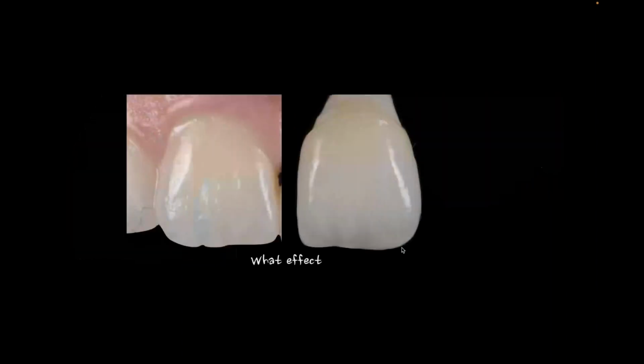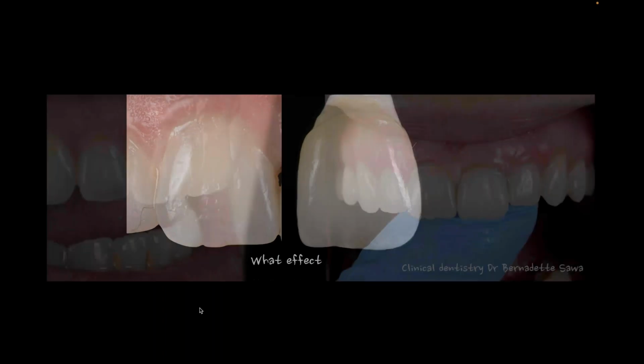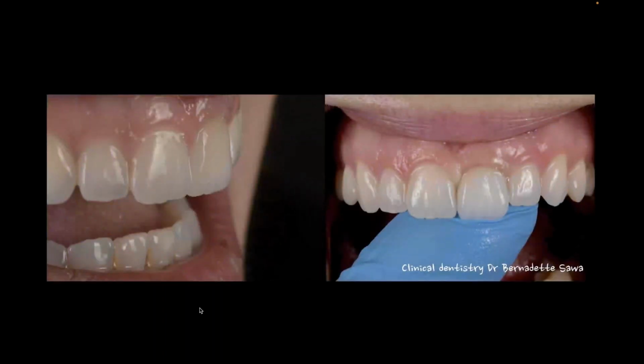So in this particular case, you can see I think I achieved it. Maybe I have a little too much translucency, although I think in real life this shows a little more translucency, and it kind of worked out in the final as we're putting this in. So single central implant, and I think you can see here now in this photo, you see a little bit more of the translucency starting to come through there. You know, my finger with that blue glove is behind it, right?